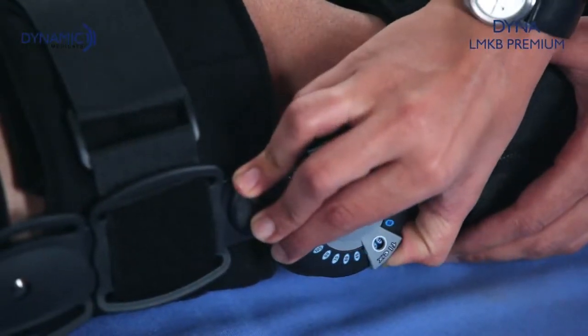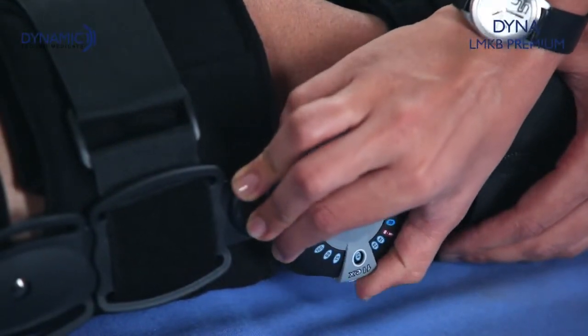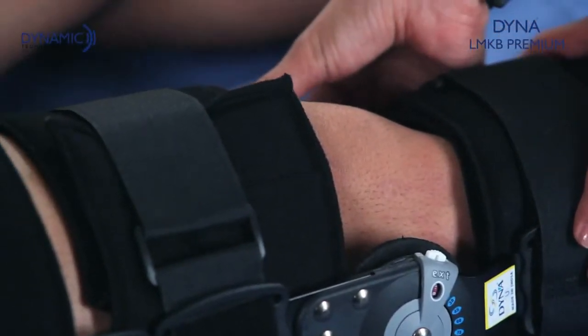Now you can adjust the range of motion to the desired level by setting the flexion and extension at the particular angles required.